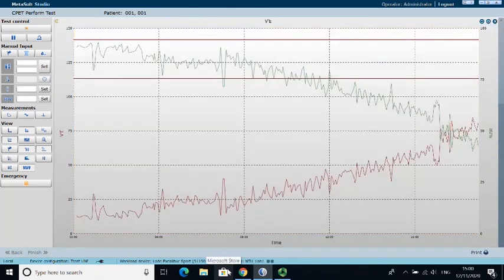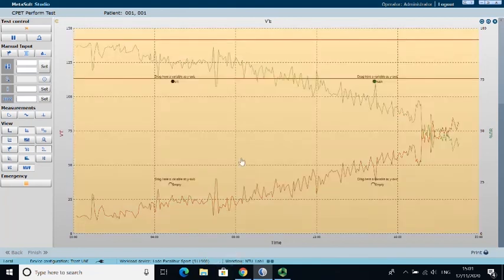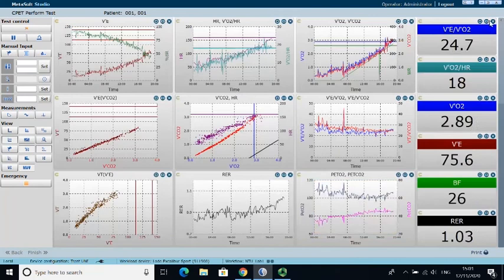So what's that? It's over 80 litres per minute now. So again, you should be thinking about what your predictions were for a young, healthy male.